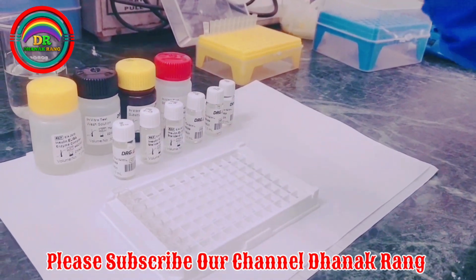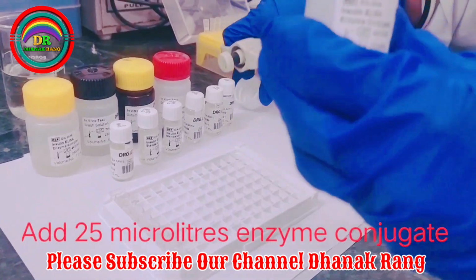Now we will add 25 microliters of enzyme conjugate in each well.